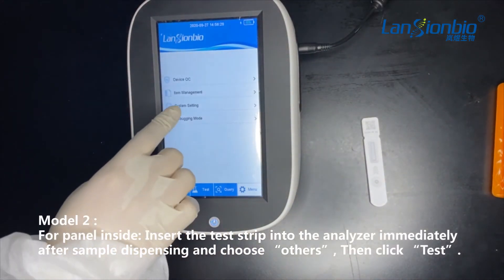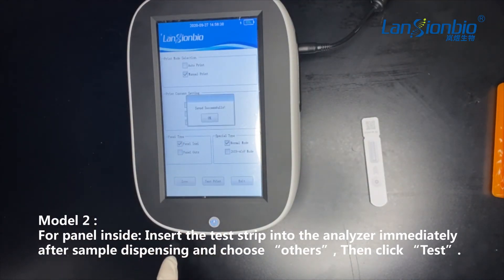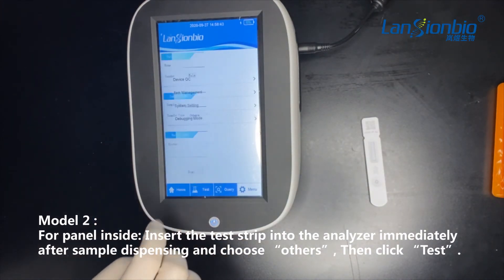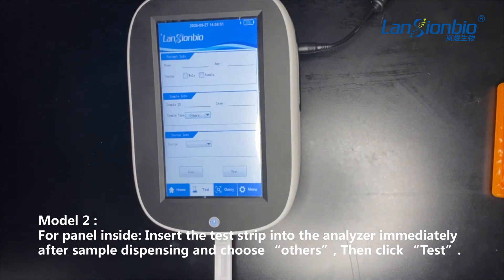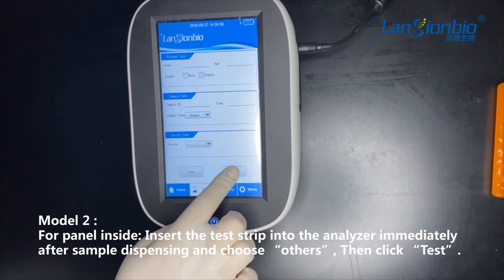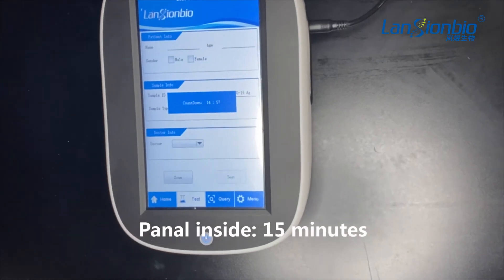Model 2, for panel inside. On the contrary, if you don't have too many samples to test, it will be better to choose this model. You can change the model in the menu, like what we do in the video. Insert the test strip into the analyzer immediately after sample dispensing and choose others, then click test. It needs 15 minutes for reaction inside for every single specimen.